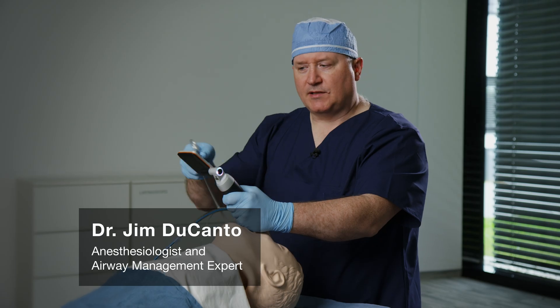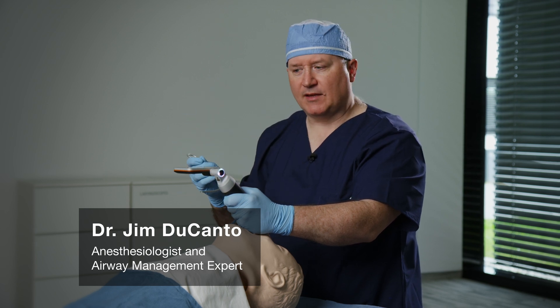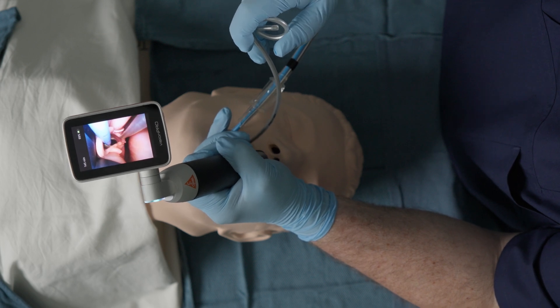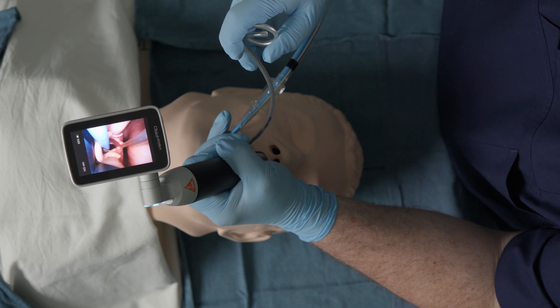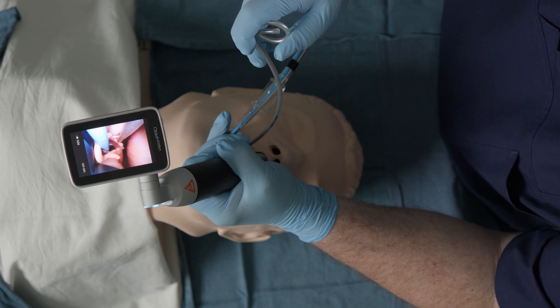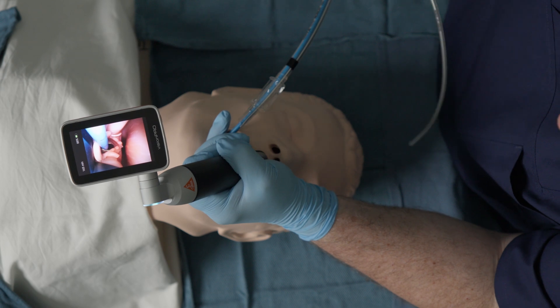I'm going to discuss a very specific problem in tracheal tube advancement over an airway intubating catheter or bougie. I'll place my metallic stylet into the mannequin model. This is the right corniculate, left corniculate, and this is the posterior commissure or interarytenoid notch. Typically, the tracheal tube will impinge on the right corniculate cartilage very close to the posterior commissure.